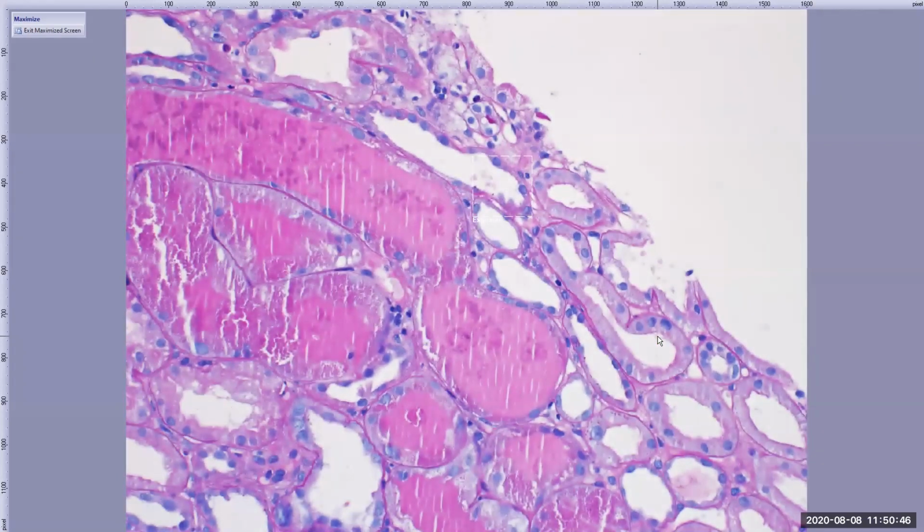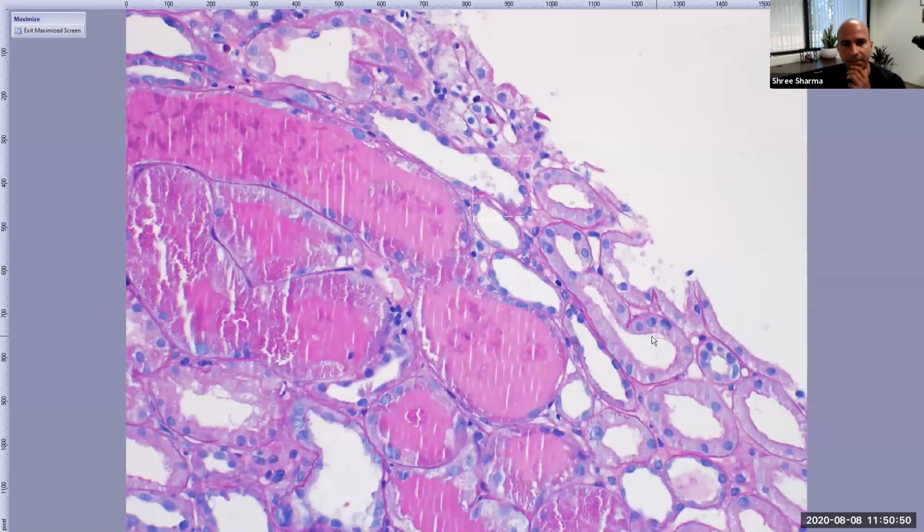Yes. We will deal with myeloma cast nephropathy later on, but let me explain some of the morphological features which will help you. This is not PAS negative or pale. It is occupying the entire tubule, but it is still showing you PAS positivity, and you don't see any cellular reaction around it. And this is not very rigid.